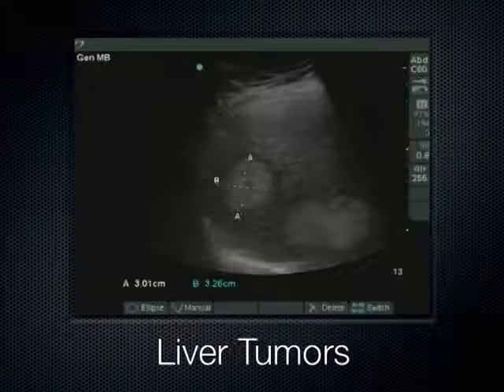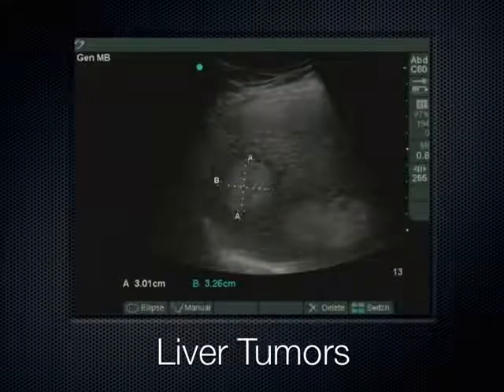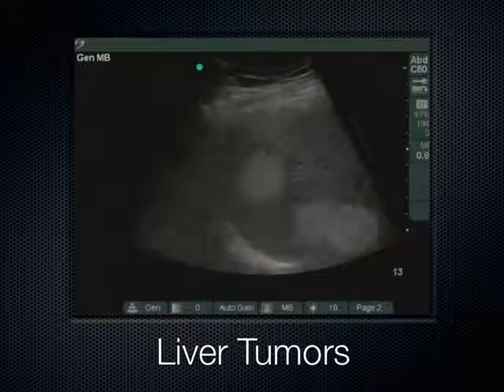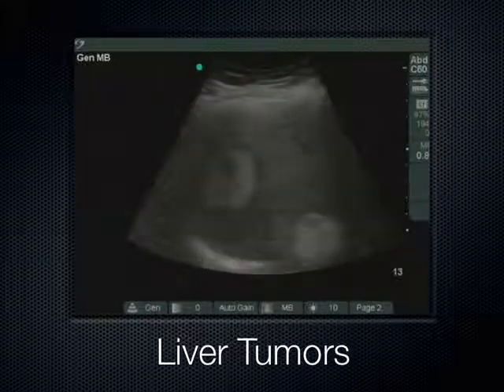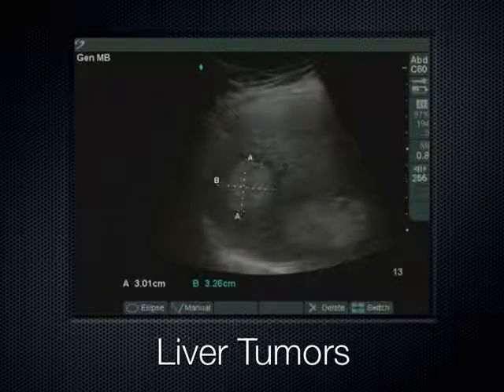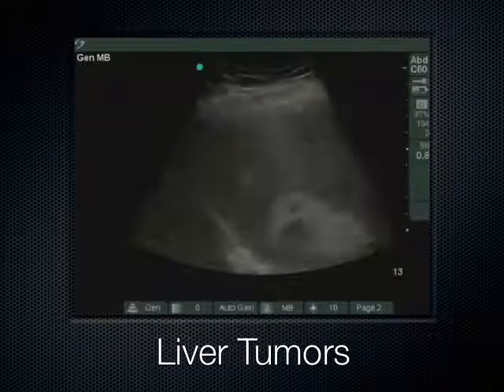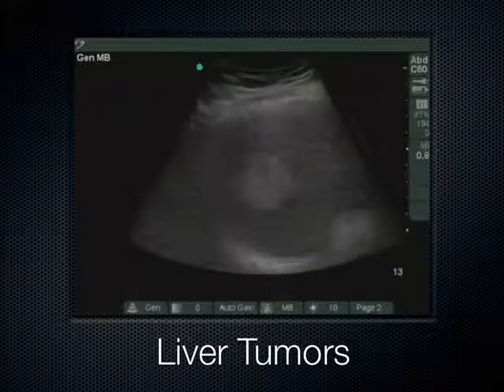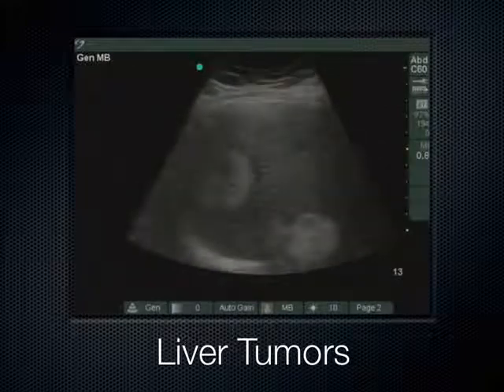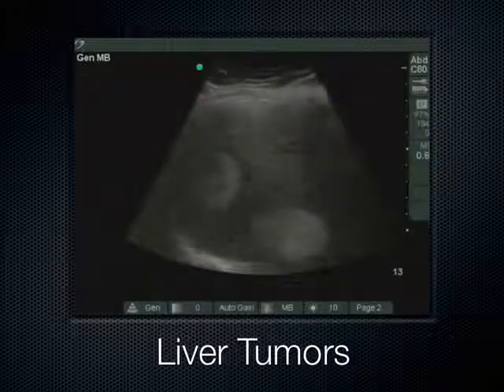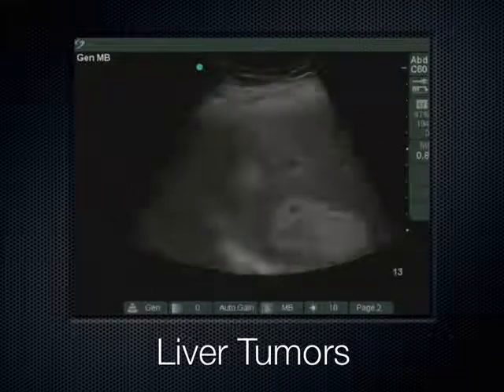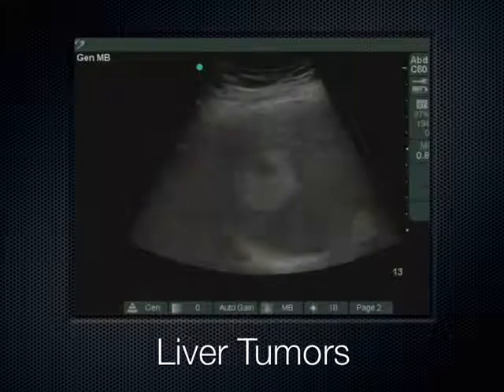The other thing we look for in the liver that you may stumble across are masses. This is an example of some solid tumors here in the liver, with the diaphragm over here. If you do see that, that's obviously something you'd want to tell somebody about.